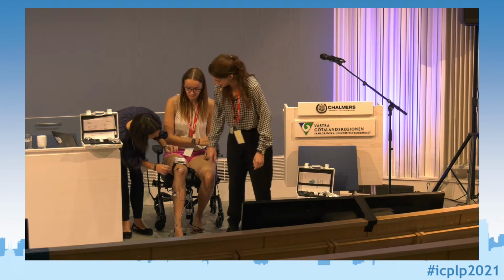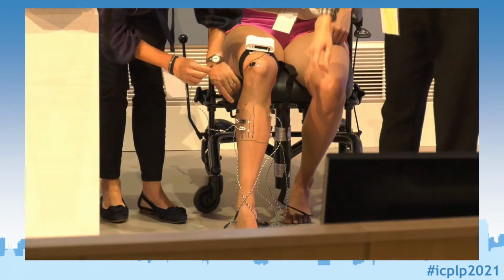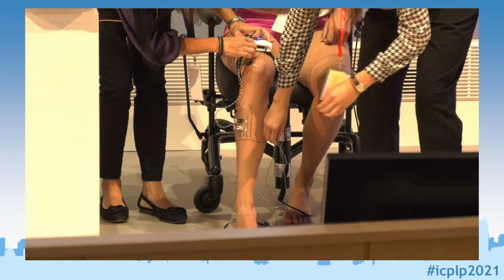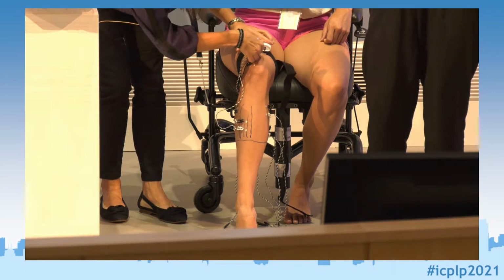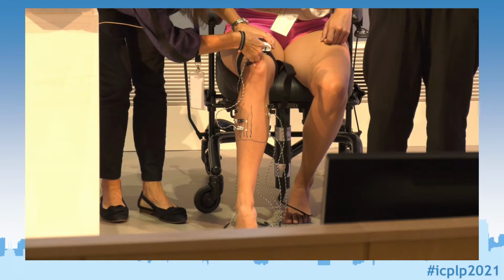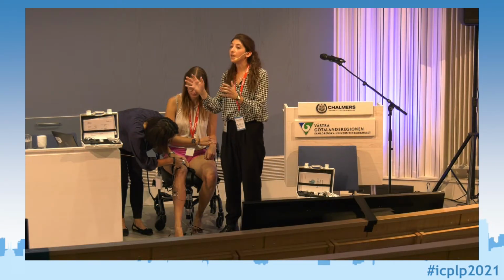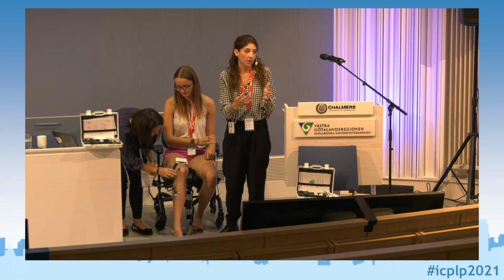Thank you very much. The reference? Yes. So then we have 7 channels in this case. As I explained before, in the beginning you normally put more channels, so then you can get as much activity as possible. But while you are progressing with your patient and you know the activation zone, then you try to use fewer channels if possible.